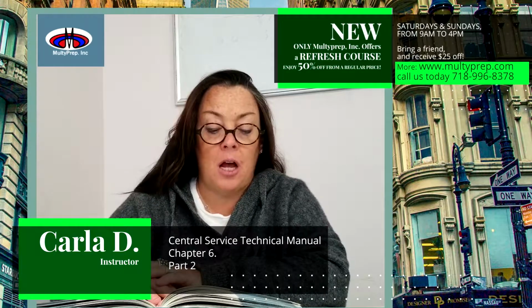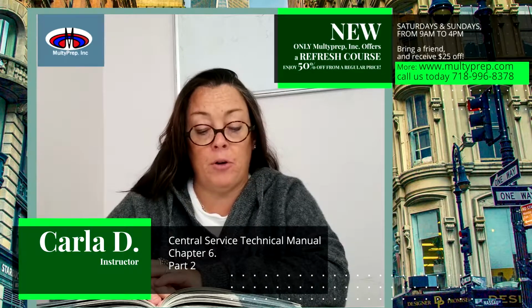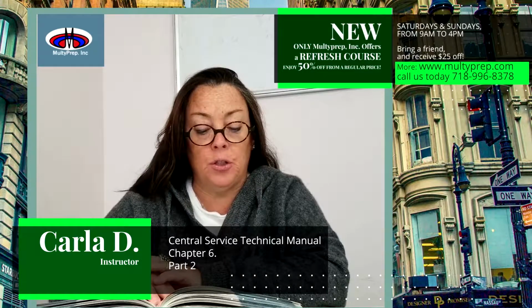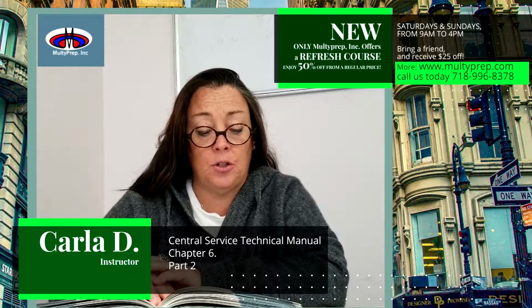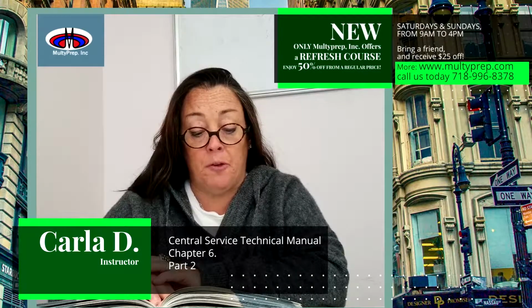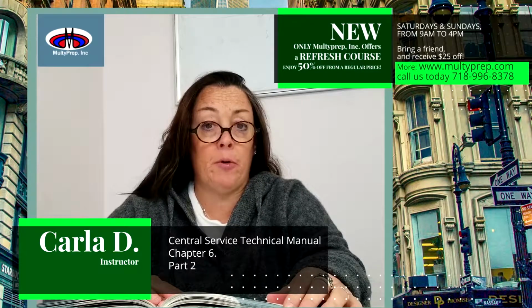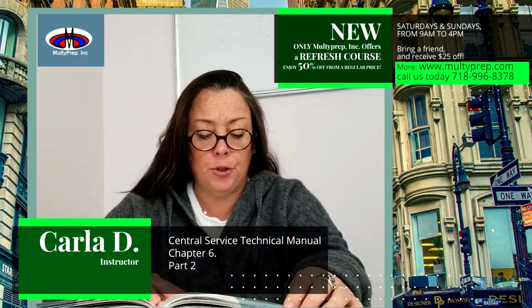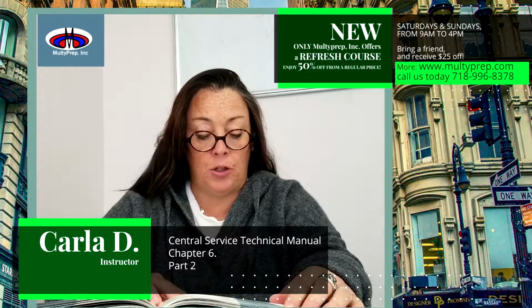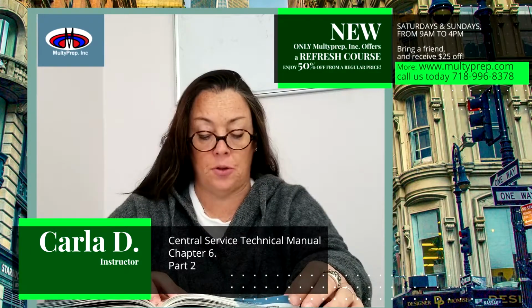Many CS housekeeping functions are performed by environmental service personnel. However, routine cleaning of sterile storage cabinets, carts, and racks is usually the responsibility of CS technicians who have been trained to properly handle sterile items and who know specific product names and locations. Other environmental cleaning requirements. Fixtures and furniture in the CS departments must be constructed of materials that may be washed, and they must be cleaned on a regularly scheduled basis.